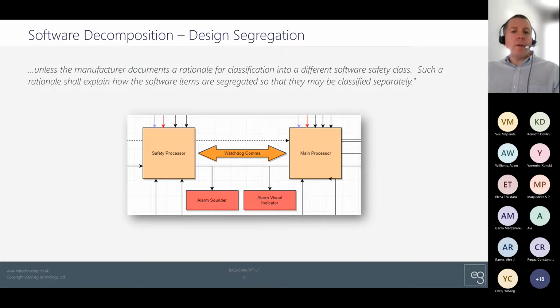But in many modern systems, the determination of an error can require much more complex measurement or a derived measurement, or there might just be simply too many scenarios to realistically cover in discrete hardware. Hardware mitigation is a valuable tool, but don't be too afraid to look for software solutions.